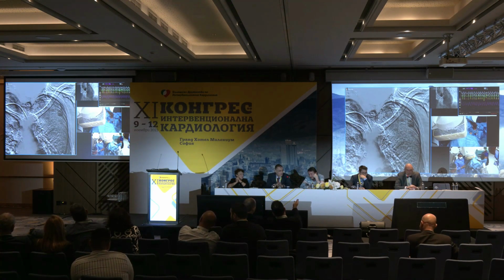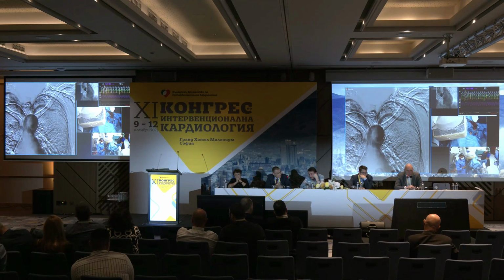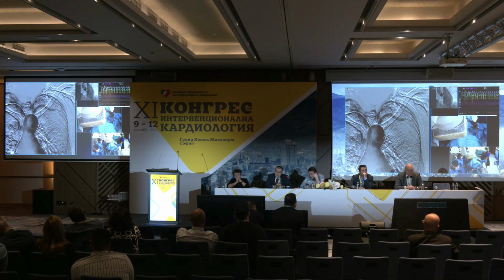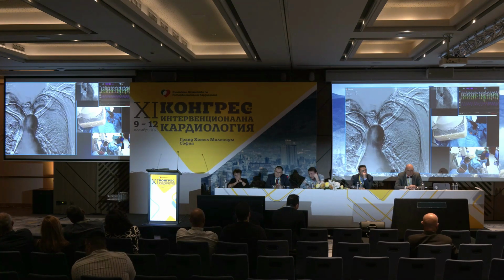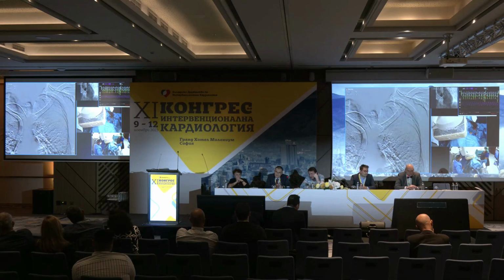Ivo? So I'm listening for you. Ivo, sorry, it's Vasil. Do we see some bleeding from the axillary artery? Yes, there is a very small bleeding. We put prostyle, and in case we are going to reduce the arterial pressure. It's also important. And we have implanted also angioseal 8 French.